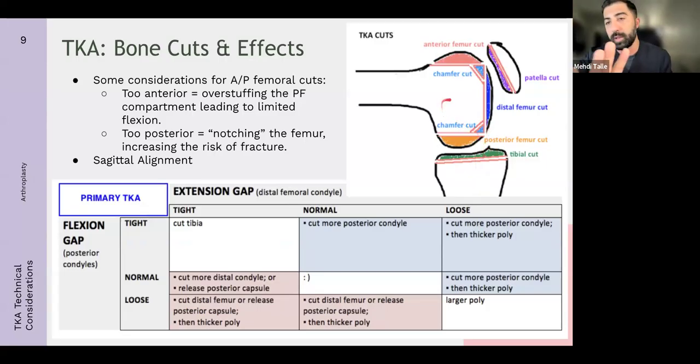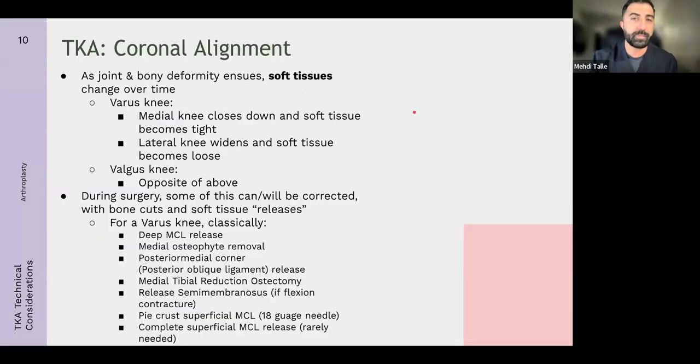So when you straighten the knee, that'll make up that loose space. And as you go through tables like this, you'll see they're actually quite easy to reason through once you understand that general difference between what your distal femur cut versus your AP cuts affect, and how your tibial cut affects both, and you can mix and match from there pretty easily. We refer to this whole concept in total knee as the sagittal alignment of your implants, and important things to consider anytime you see surgeons go to make their cuts during surgery.